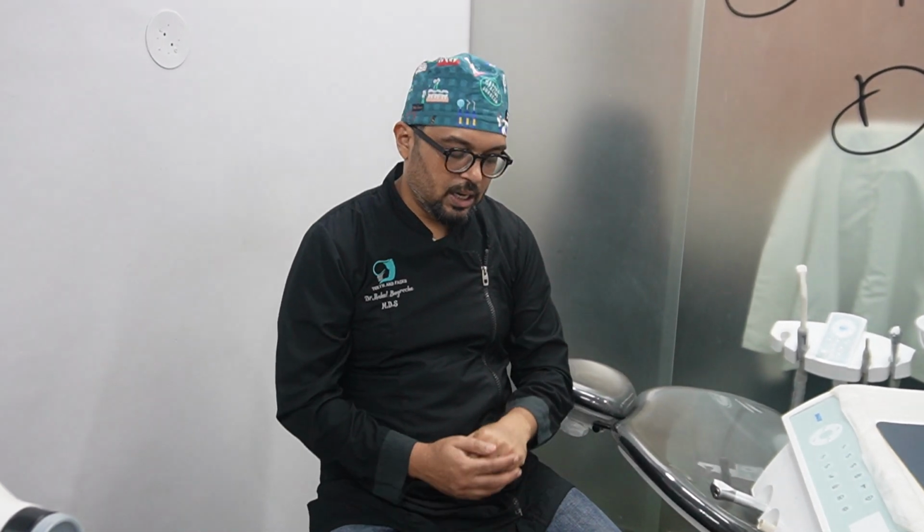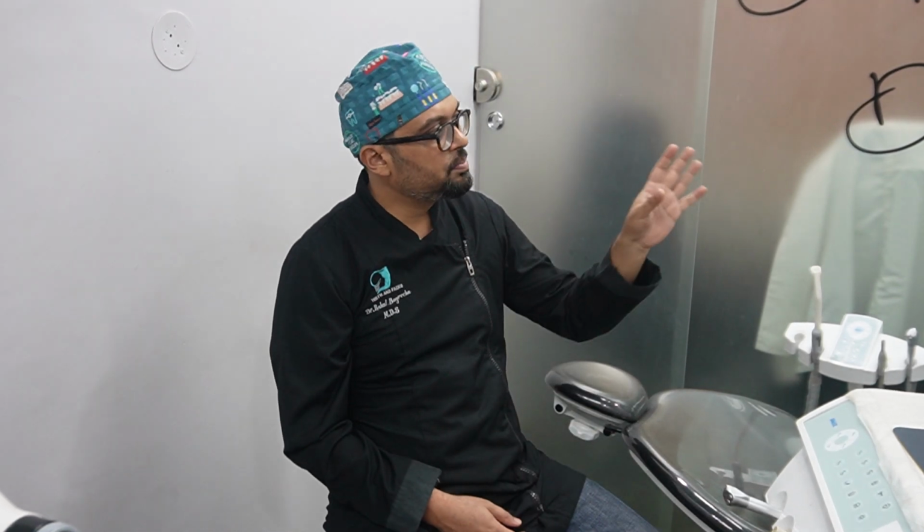So this is the first step of the digital implant surgery, or digital implant workflow, which I talk about a lot, where my digital data helped me do a virtual surgery before actually doing a surgery on a patient. We'll be operating in another 15 minutes. This planning was already done yesterday. This is just for explanation and video purposes that I'm showing this planning. This planning has been done yesterday, and the implants are ordered accordingly.